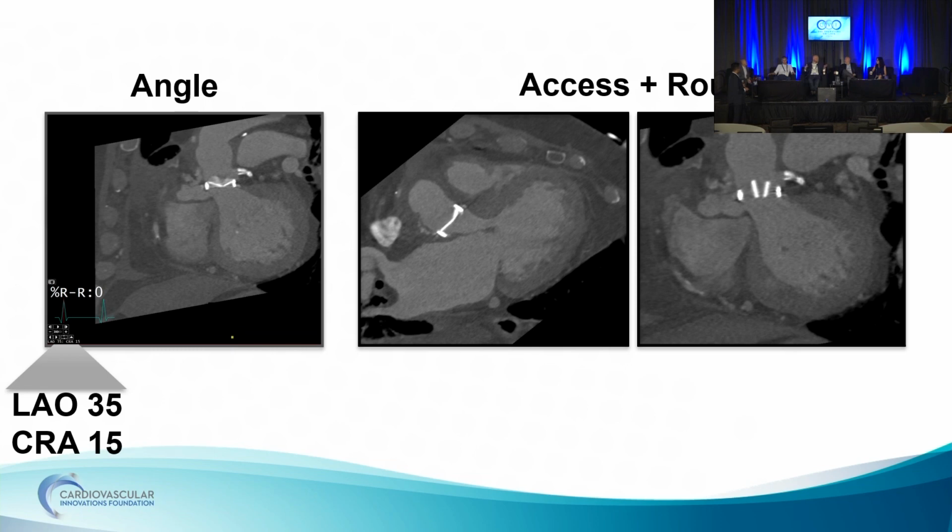It's not perfect. Yeah, and I do like the locking feature of the Oscor more so than the Agilis. I'm a Direx disciple. Direx, which is a Boston product. You haven't used it because you hate saving money, but the Direx is like a third the price of an Agilis, and it also has a locking feature. So it's got a ratchet on it? It has a locking feature?